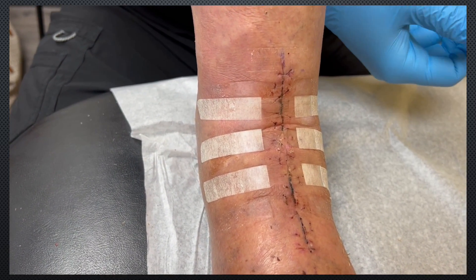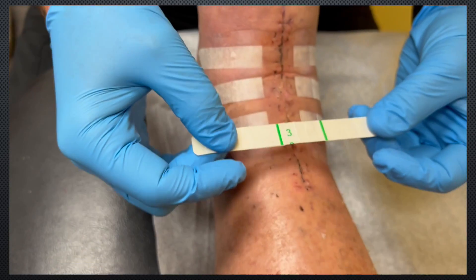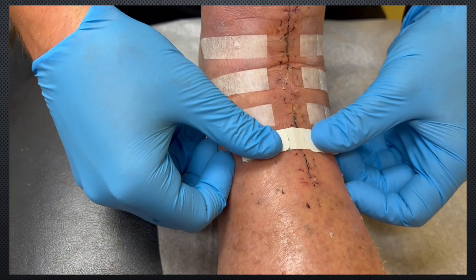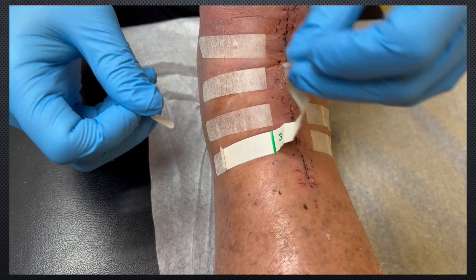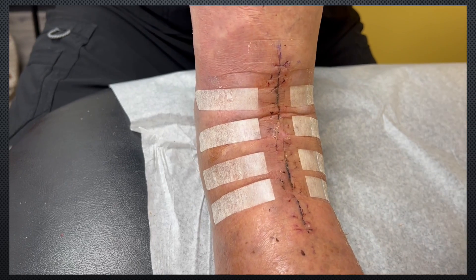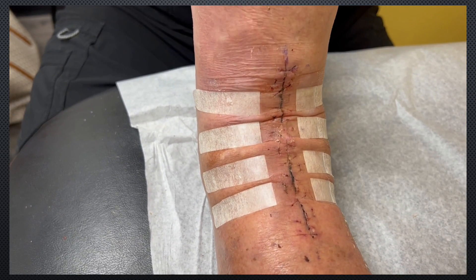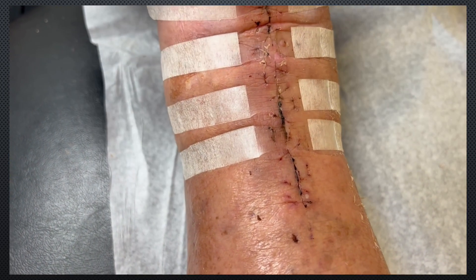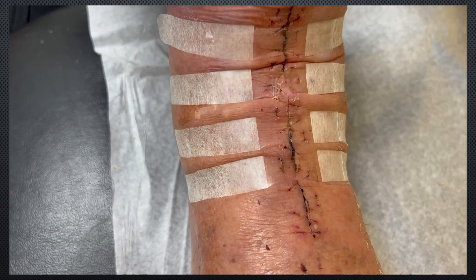In this patient, we didn't have any ancillary procedures other than a tendo-achilles lengthening, so no incisions to work around. But if there are extra incisions, then you can place these obliquely to avoid those. So now when we dorsiflex and plantar flex, the Steri-Strips come apart just a little bit, but that elastic is helping alleviate some of the tension that normally would be placed all at the incision line.